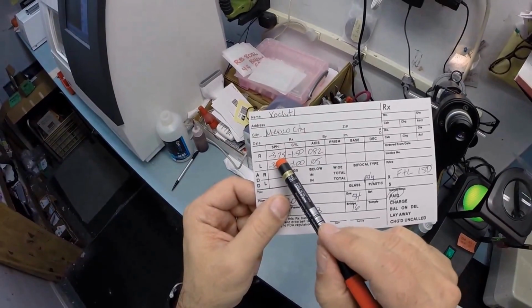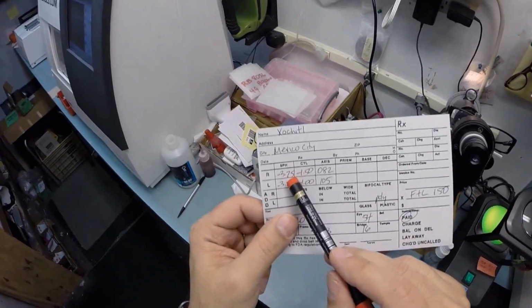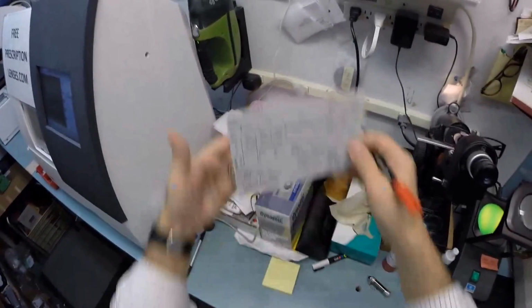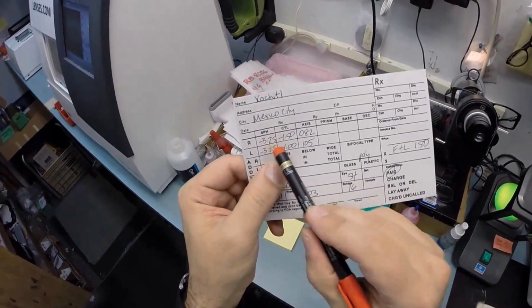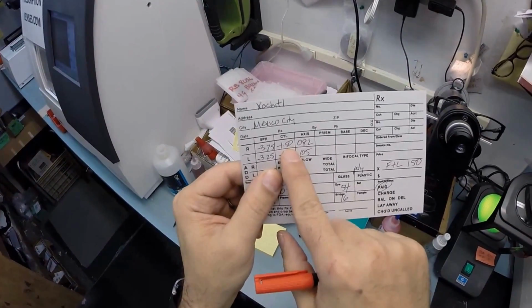So you're at 375. So you need 15 steps of correction for your nearsightedness. Without your glasses, you are nearsighted. Without your glasses on, you can see everything near, but once it gets beyond arm's reach, it starts to get blurry. So you need 15 steps of correction for that. You need an additional 6 steps for your astigmatism correction.